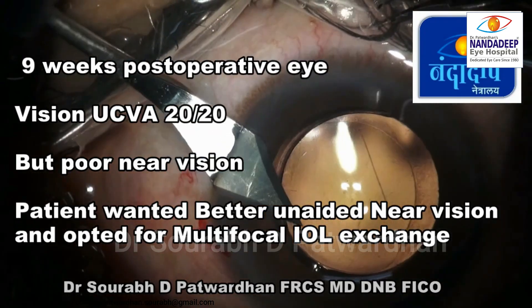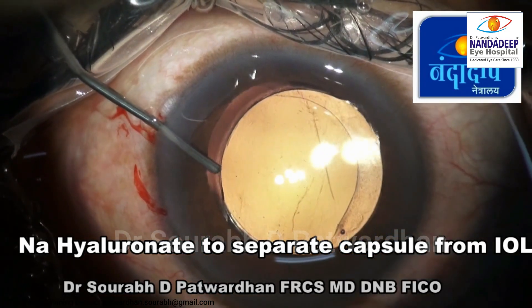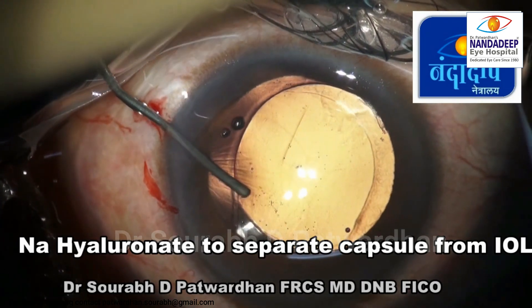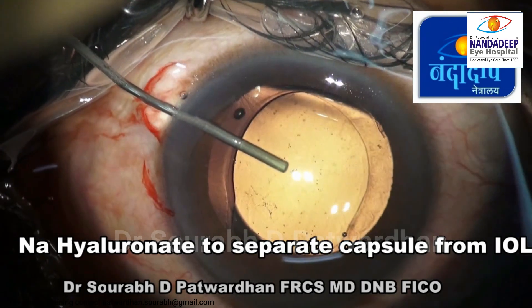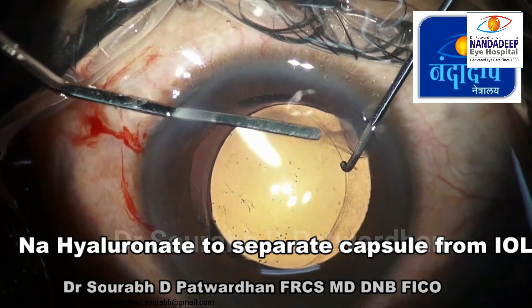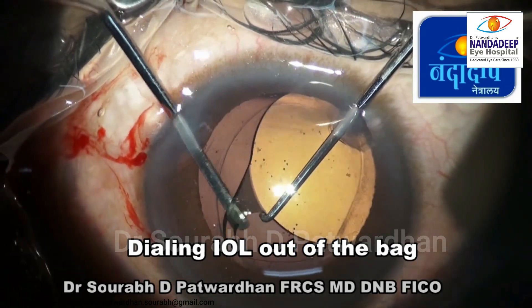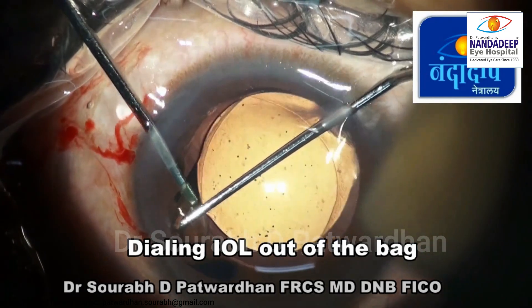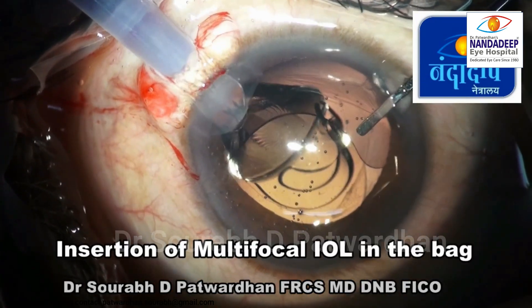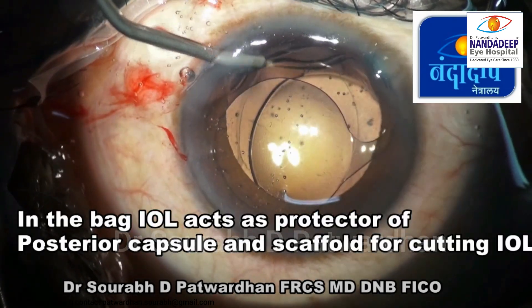This is an interesting case where the surgeon had put a monofocal IOL but the patient was not happy with near vision and wanted exchange with a multifocal. When the patient presents after two months, it's important to separate the hydrophobic IOL from the bag. Sodium hyaluronate can be used to gently viscodissect the bag, use an iris repositor to release adhesions between the posterior capsule and the optic, and carefully dial each haptic out. For protection of the posterior capsule, you can use the IOL scaffold — put a second IOL in the bag before removing the previously implanted IOL.